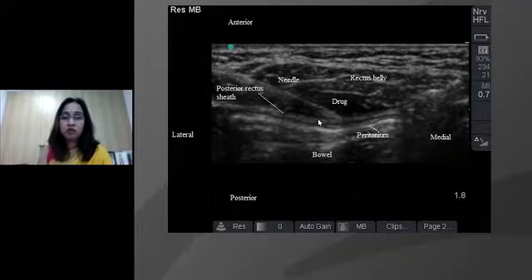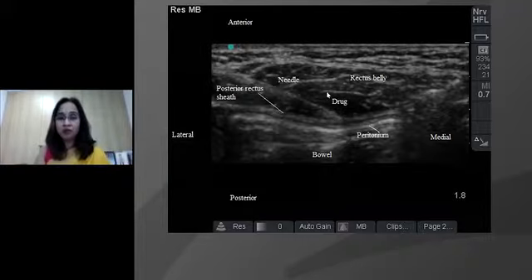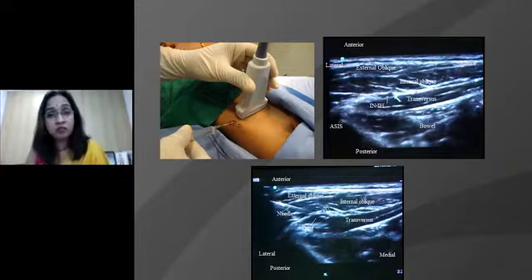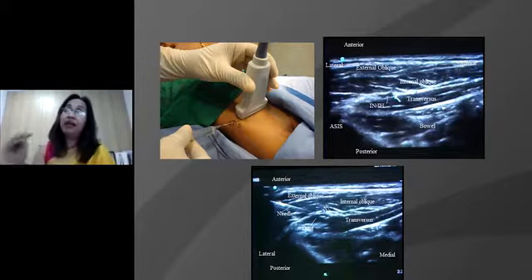So this is how a really good injection would look. You will have the peritoneum as well as the posterior rectus sheath sinking down because of the drug, and this is the muscle that has gotten separated, and it creates a kind of spindle-shaped or hammock-shaped spread. This is again the ilioinguinal iliohypogastric block for the most common surgery that can be undertaken in infants, which is hernia surgery. But this is an analgesic block; I do not claim that the entire surgery can be done only under this block.